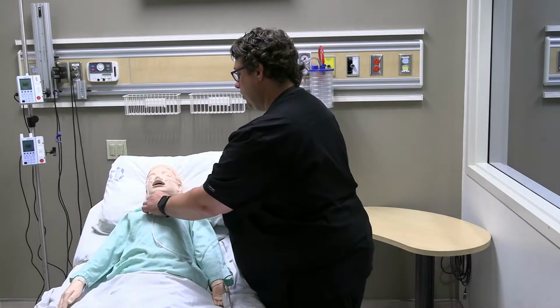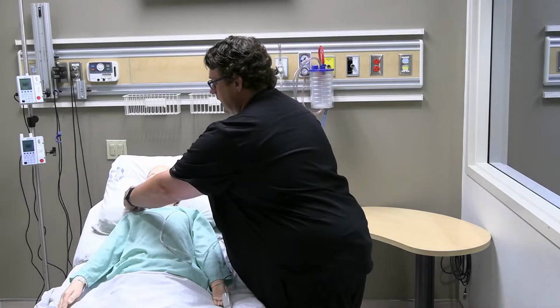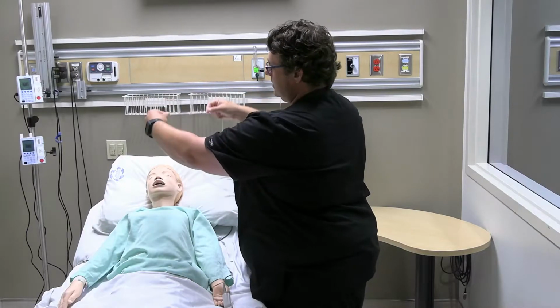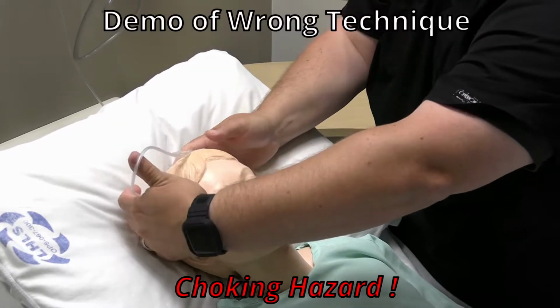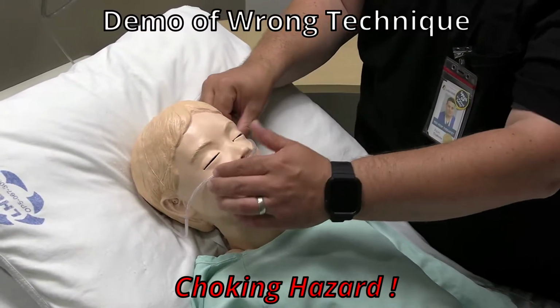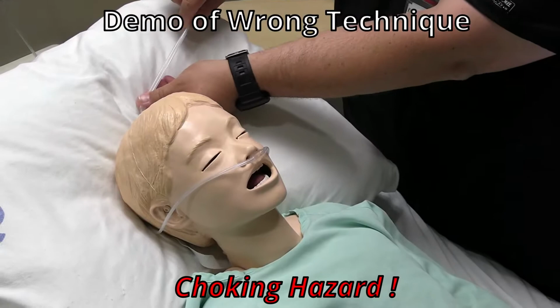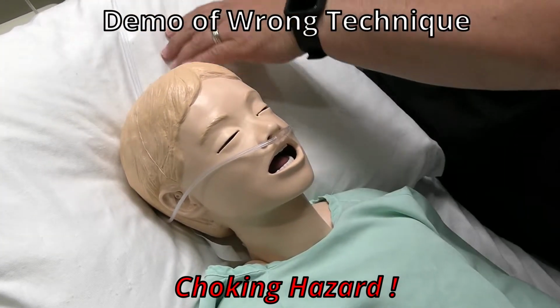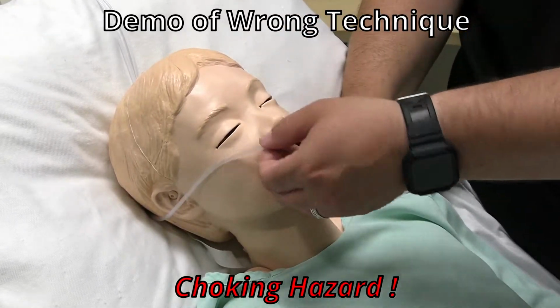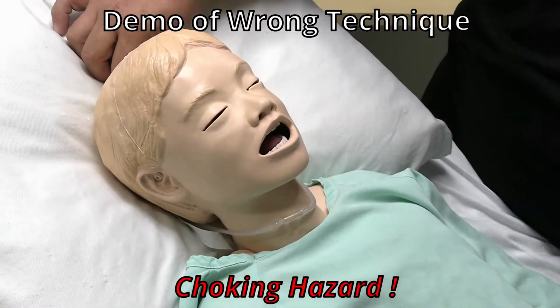The next thing we want to advise you not to do when you're applying nasal prongs to children is to do this technique here that we see quite frequently. That's, again, still inserting the nasal prongs, but you're coming in from behind the patient, applying it and then going around the patient's head just like this. So it's away from the patient. That's the thought. The problem is that it could potentially slide down on your patient like this and become a choking hazard. So we don't want to do that.